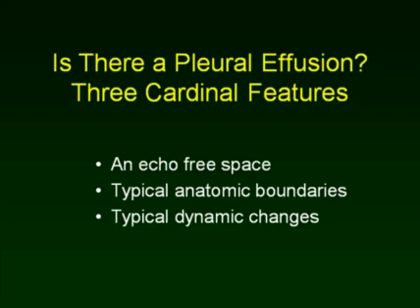And really, when an intensivist or EM clinician is performing pleural ultrasonography, they have a simple question: is there a pleural effusion? And what I'd like to emphasize is that the clinician will want to look for three cardinal features of pleural effusion.